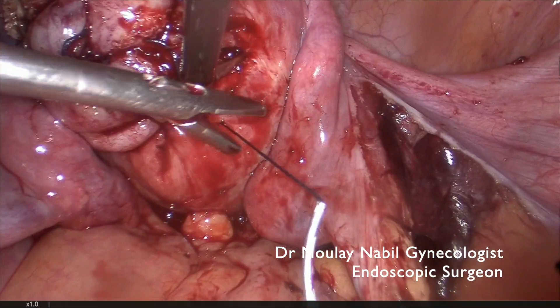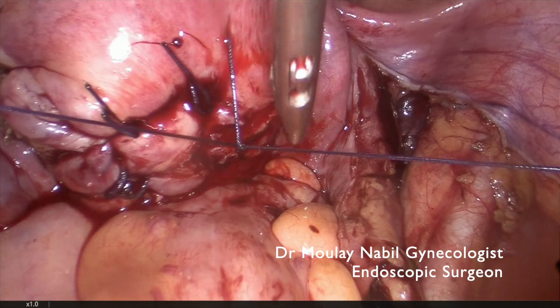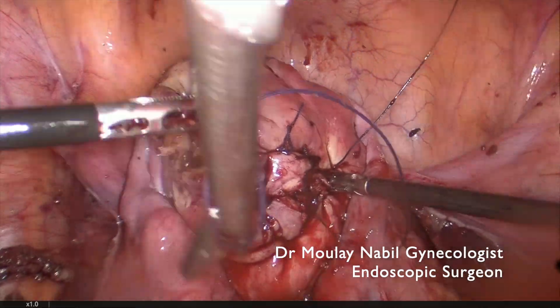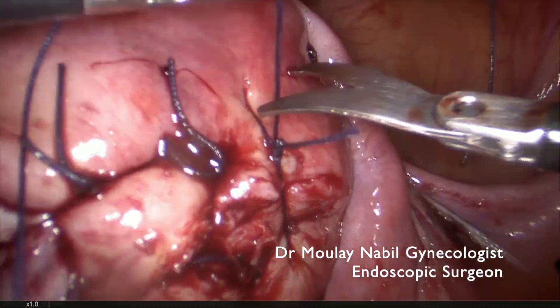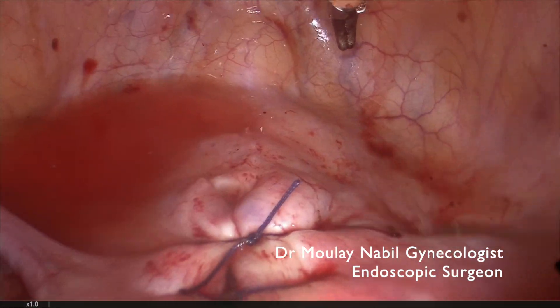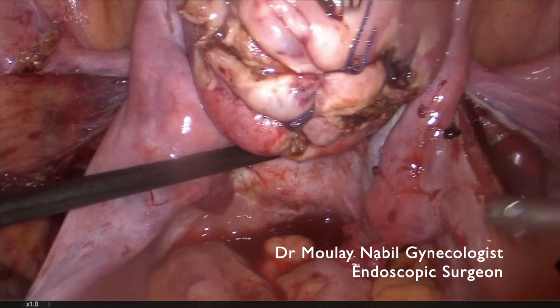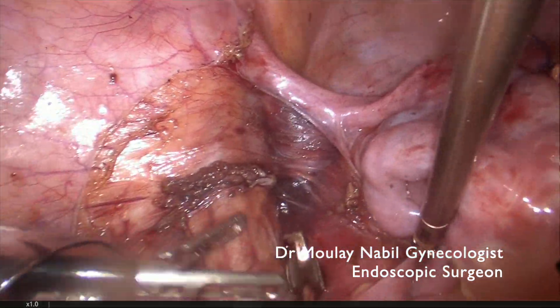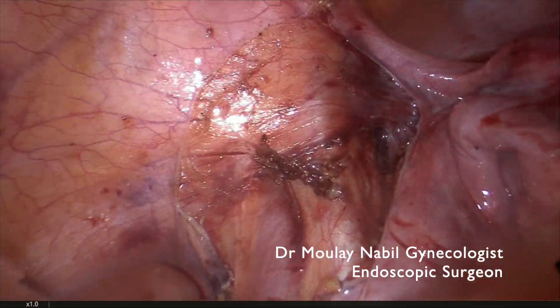It is important to have the knowledge of the suturing technique with both hands — right hand and left hand. This is our last stitch. You can see the anatomical result is quite good. We now control the anterior aspect of the uterus — no bleeding. The posterior aspect — no bleeding. The tubes are normal, and there is no stitch near the tubes.